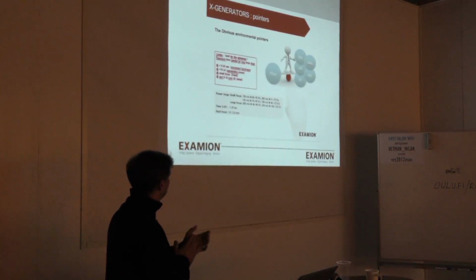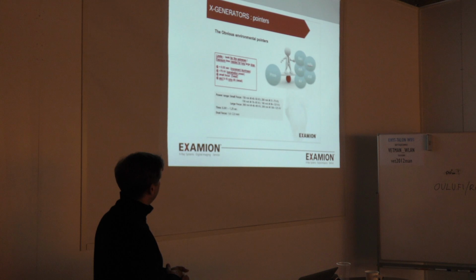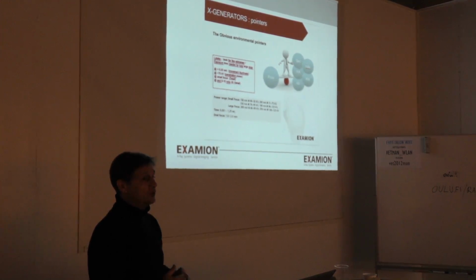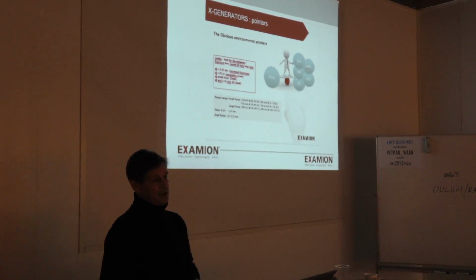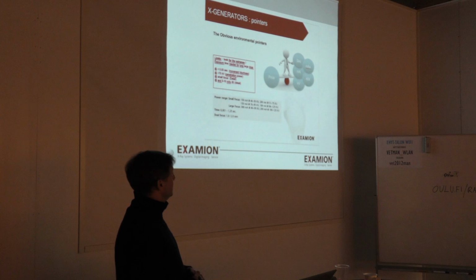And here you see, for example, in the red box, something I always find a criterion in the small animal department: you have to try to find out where the limits are. So you have to look for the extremes in X-ray. In small animals, it's very important, I think extremely important, to find a machine with an extremely short exposure time. Because if you have a long exposure time, animals breathe, they move, they are in stress, they have dyspnea, whatever, and you will actually get blurriness. So you have to try to avoid that.